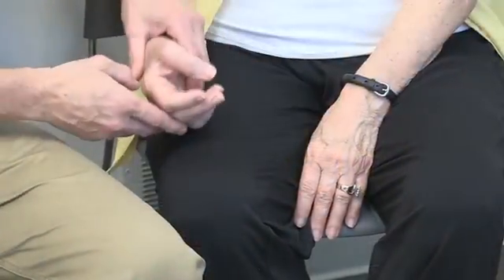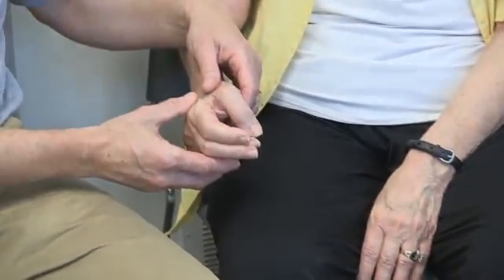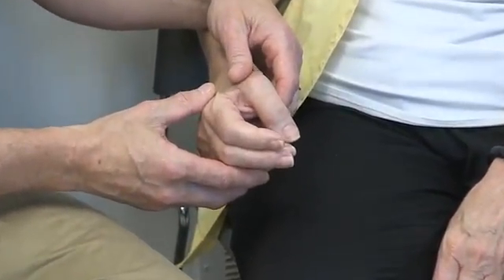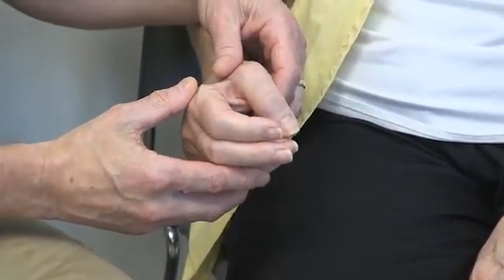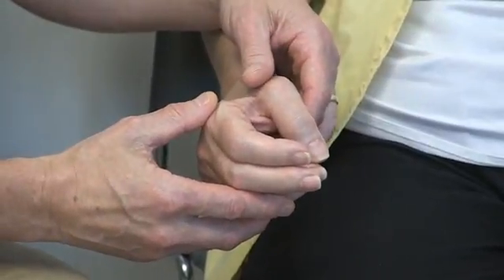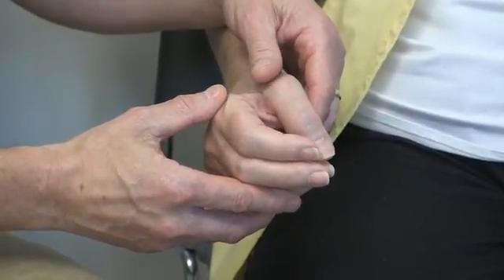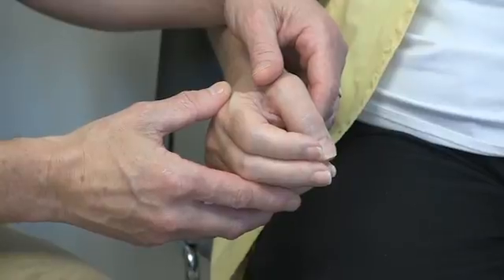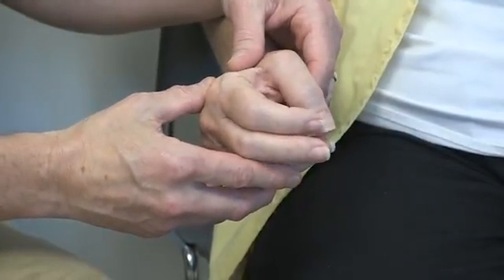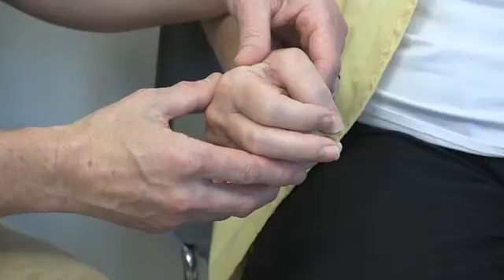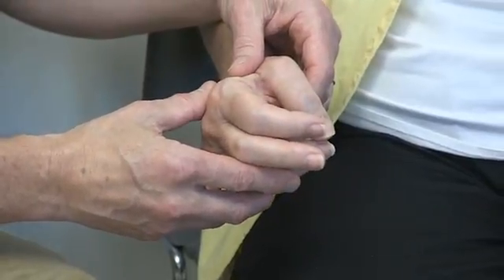Let's take a look at Linda's hand. You can see she has some weakness in her thumb. Her thumb is not in the ideal position for any type of functional pinch. Go ahead and try to pinch your index finger to your thumb. So today we're going to fabricate a splint to make that better.